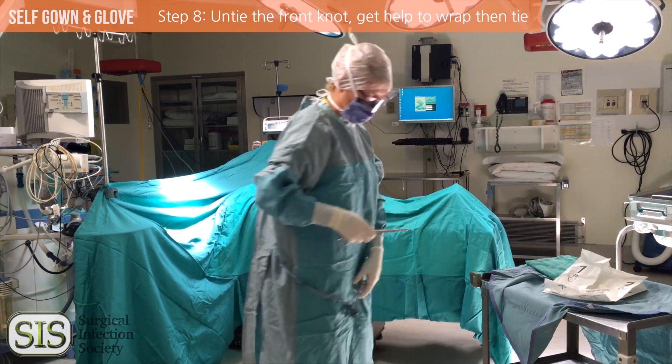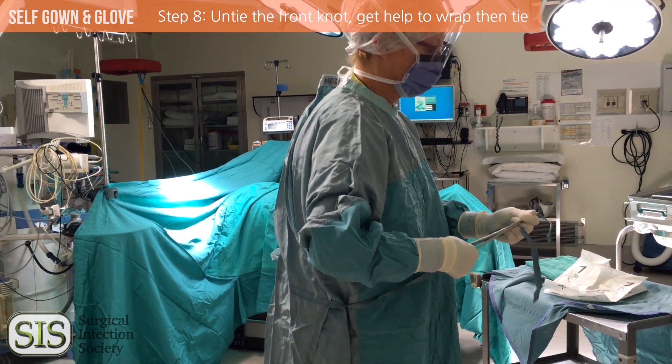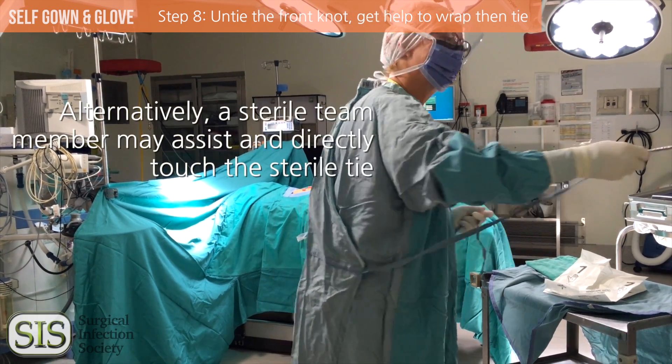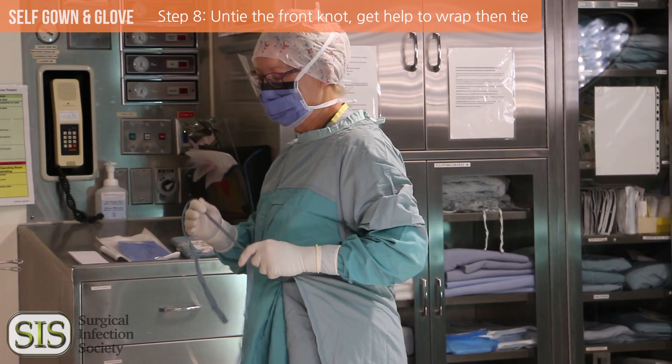Untie the knot at the front. You can touch the sterile tie at the front of your gown. Undo the tie, hold onto the left end, and clamp the right end using a clean clamp. Hand the clamp to a non-sterile team member. Turn, take back the tie, and tie it at your side.